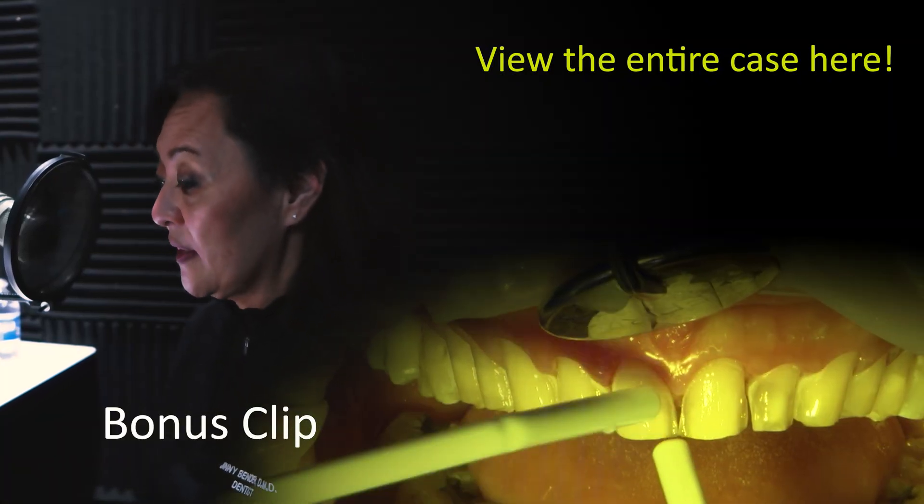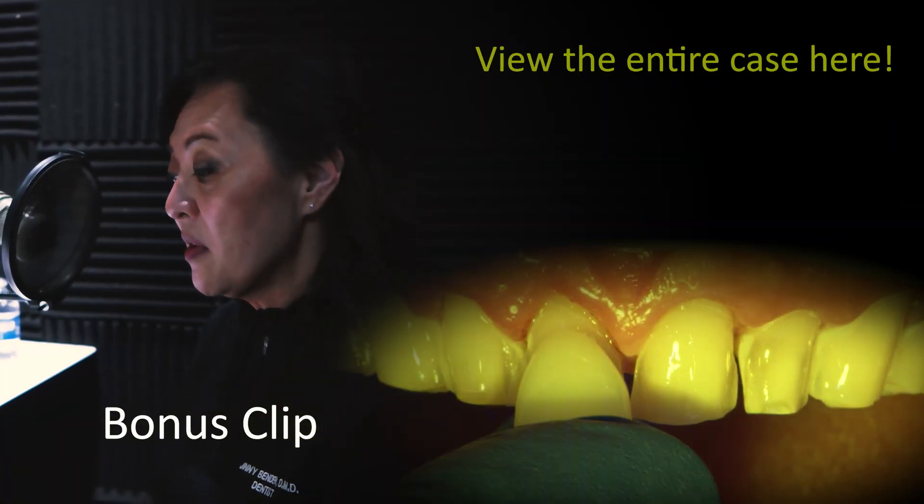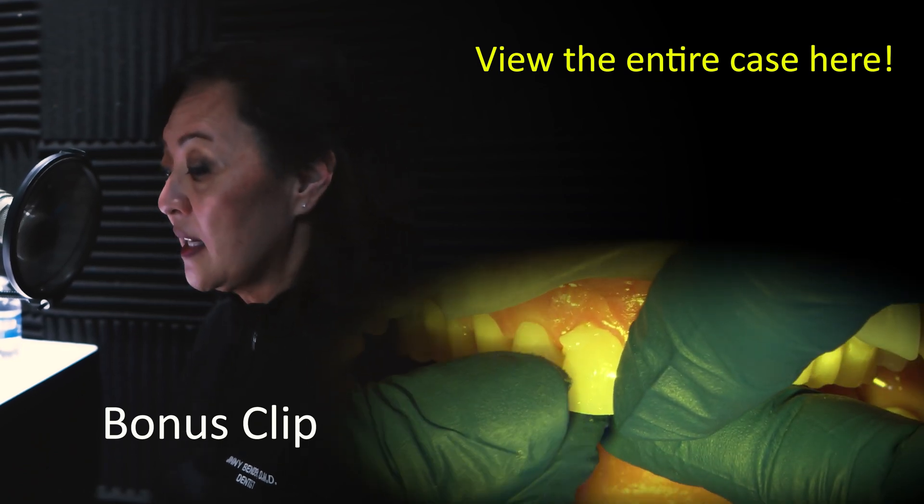I typically deliver my veneers at the same time. I start with numbers 8 and 9 first, then the others are seated in sequence.